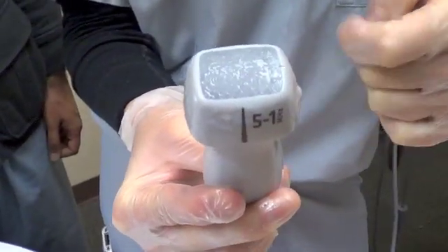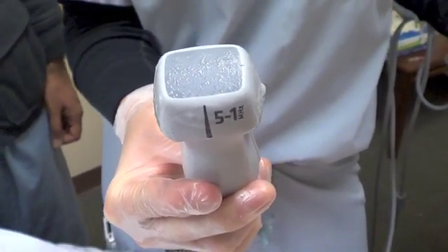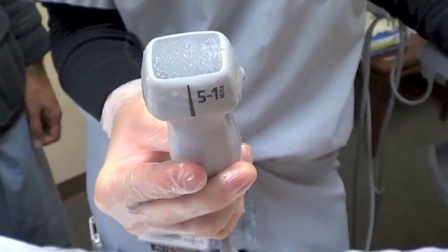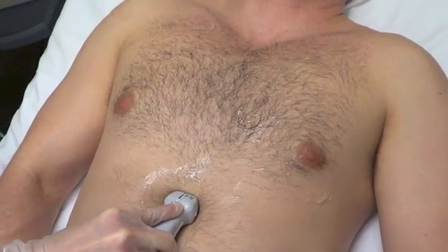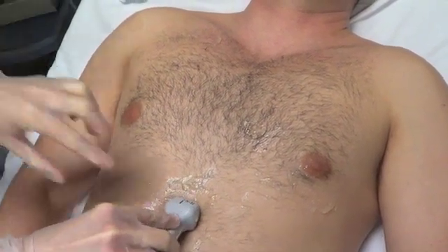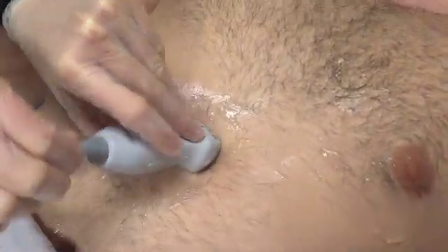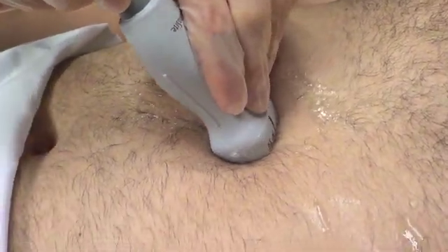The indicator is here on the side. When we do cardiac, we want to make sure the machine is in cardiac preset, which flips our indicator from the patient's right to the patient's left. We're going to start in the sub-xiphoid area with our indicator towards the patient's left to get our sub-xiphoid view. Make sure that when you're doing that view you shallow your probe — you don't want to be angled up looking at the aorta. Think about where your probe is looking.